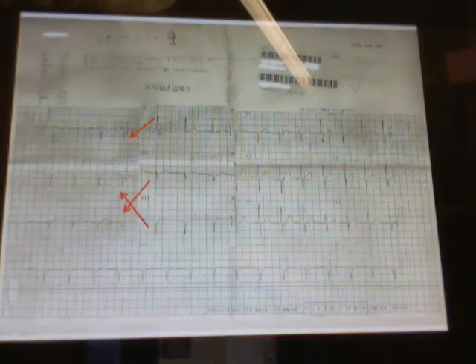So based on these two limb lead connections, we make a diagnosis that the first line has the leads reversed, and the leads that are reversed are the right and left arm leads.